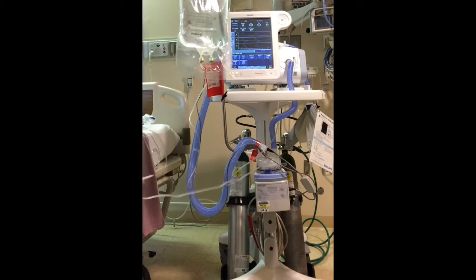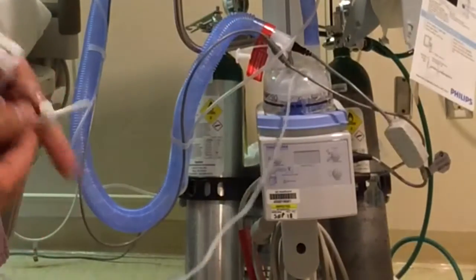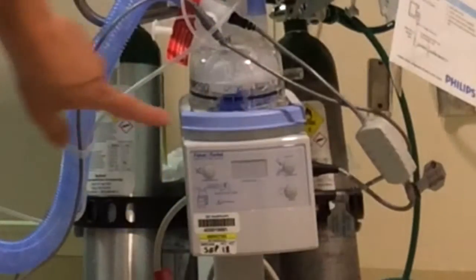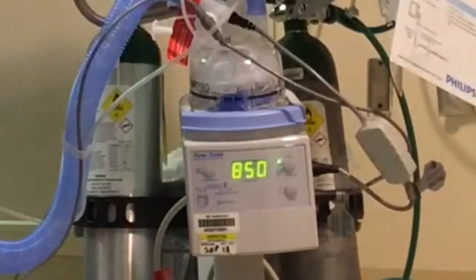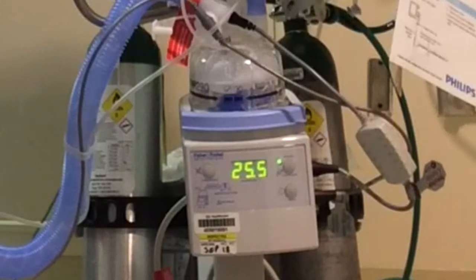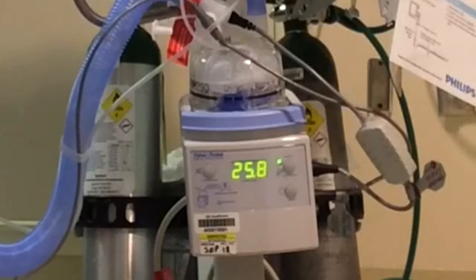If your patient says that they're feeling really dry, you can also turn on your heater, and there's a plug on the back. I'm going to plug that in really quick. On your actual heater, the on button is on the bottom right hand side. There's two settings to the heater. You're going to have an invasive and a non-invasive setting. The non-invasive setting is the setting that I like to use. You don't get much rain out within your circuit, and it's more comfortable.